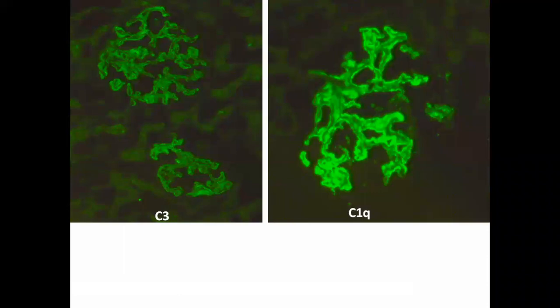And if C3 is there and C1q is very strong, with multiple immunoglobulins, that means IgG, IgA, IgM, C3 and C1q, practically it is a full house immunofluorescence pattern. But I must tell you that in all cases of class 5 lupus or membranous lupus, you are not going to see a full house immunofluorescence pattern. In around 40 to 45% of patients, you are not going to see the full house pattern. Complements will be normal, sometimes DNA is also negative.